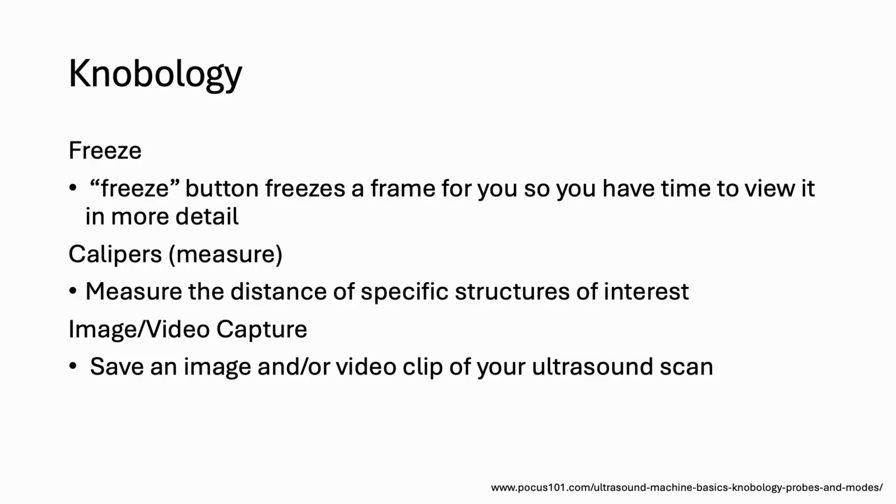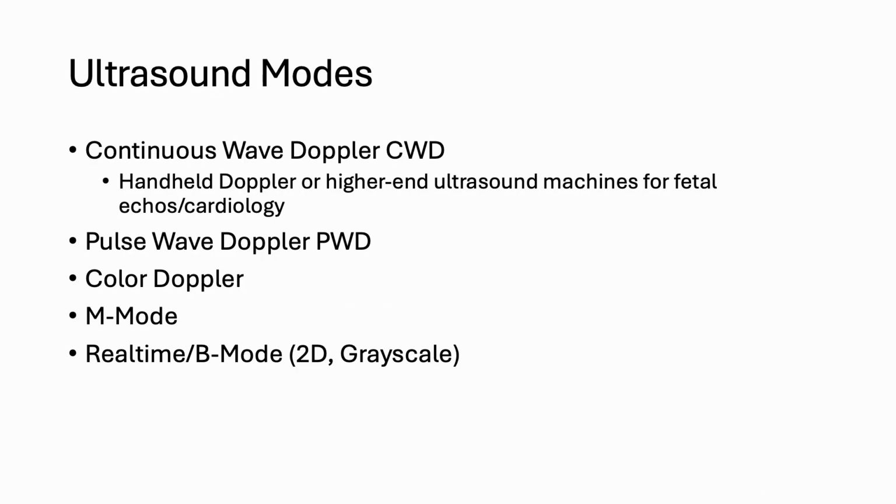So especially when you're wanting to confirm that you don't have twins and you want to document that you confirmed that, you can go through both planes of the uterus to show that you did in fact look at the entire uterus.